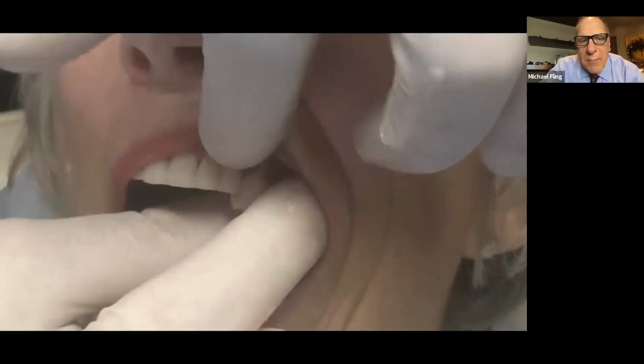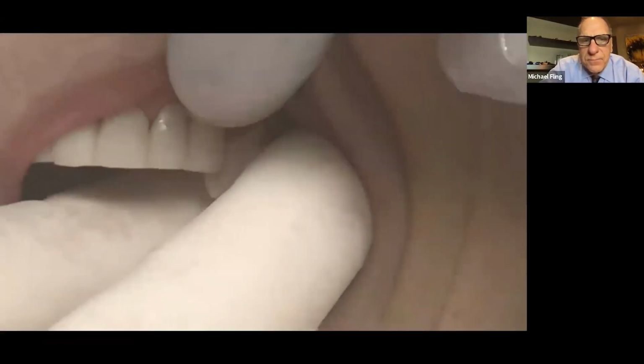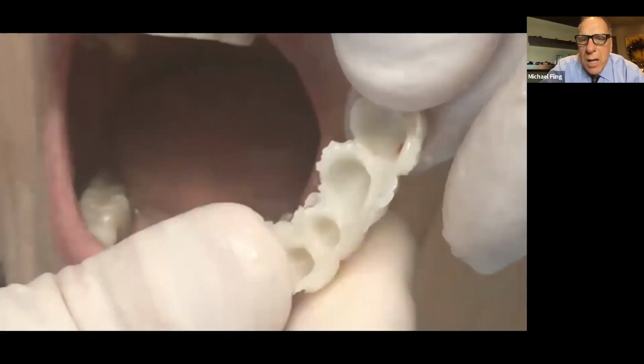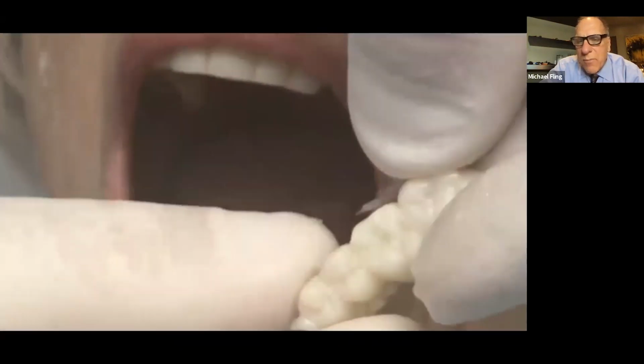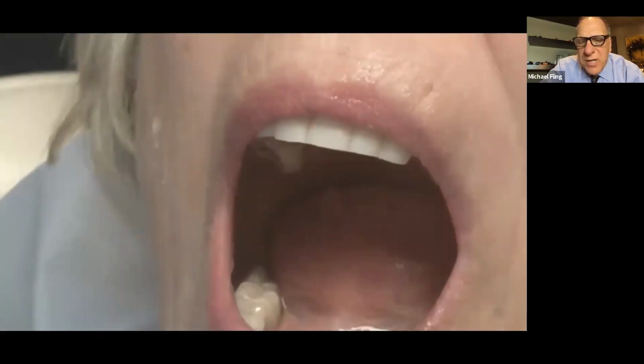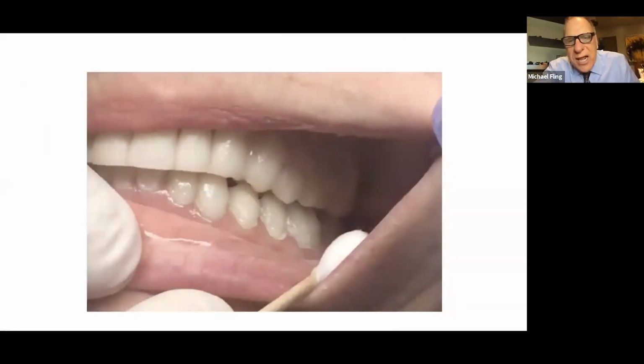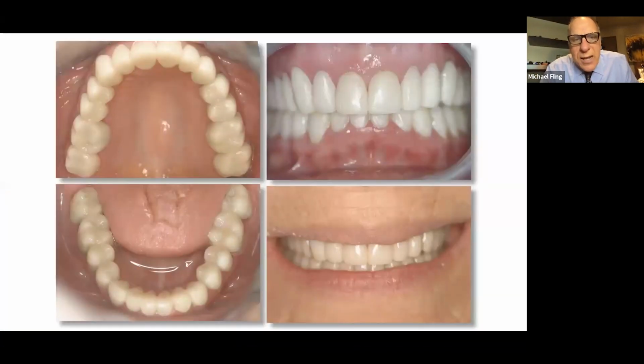So now I'm going to remove that. And I'll go back with my diamond burr. I'll relieve the excess. I'll go back with my disc to clean up interproximals. And my occlusal adjustment, whether it's reduction or addition, is just so minimal because I've been able to use this to seat it so that her occlusion helps dictate exactly where that should go. So it really makes this nice.